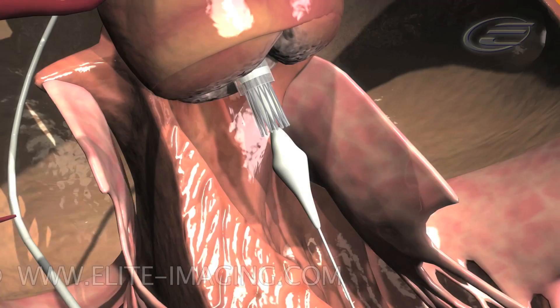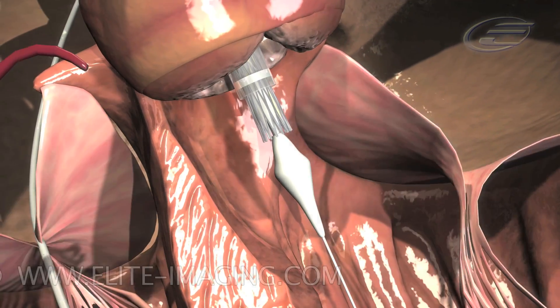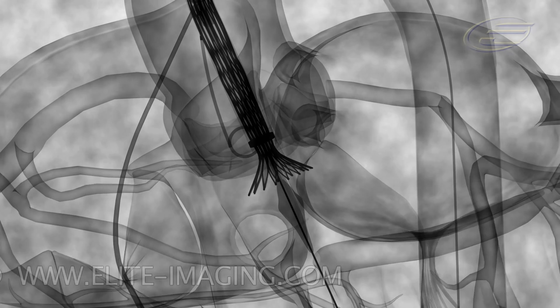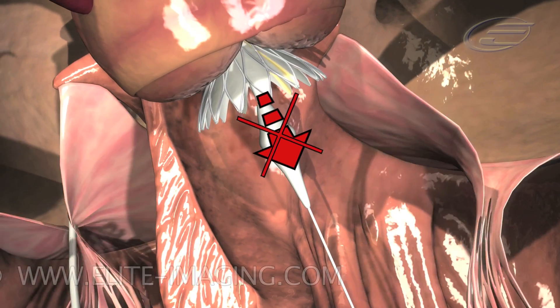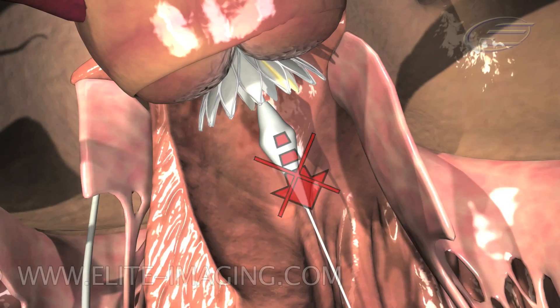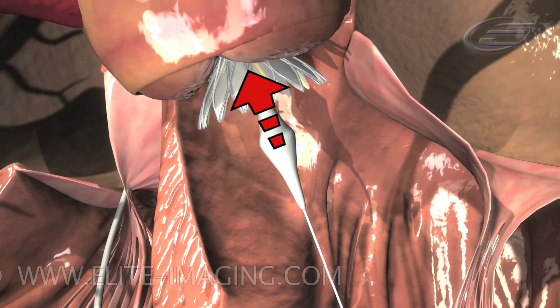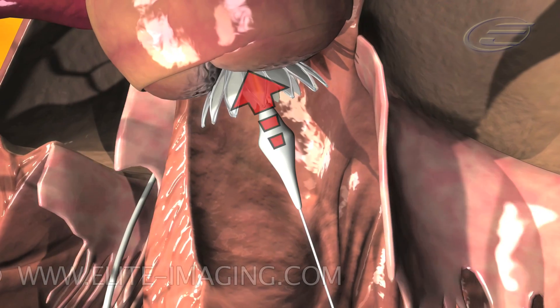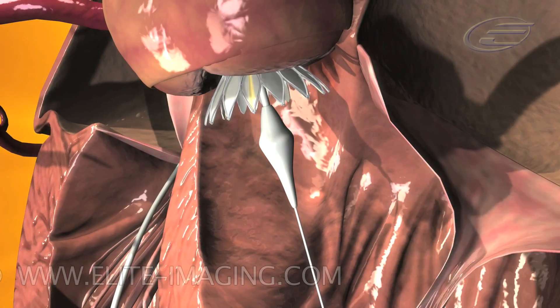Perform an angiogram. The valve can either be advanced or withdrawn as long as annular contact has not been made. As the inflow aspect of the valve starts to flare outwards, monitor valve position under fluoroscopy. Note: once annular contact is made, the frame cannot be safely advanced into a lower position, and the force required to move the valve into a higher position becomes noticeably greater. Careful assessment of frame position relative to the annulus is highly recommended for optimal implantation.